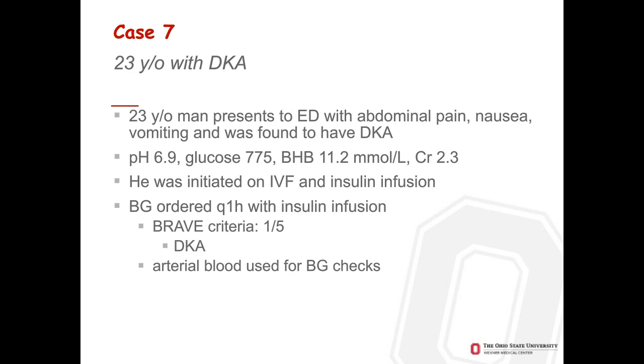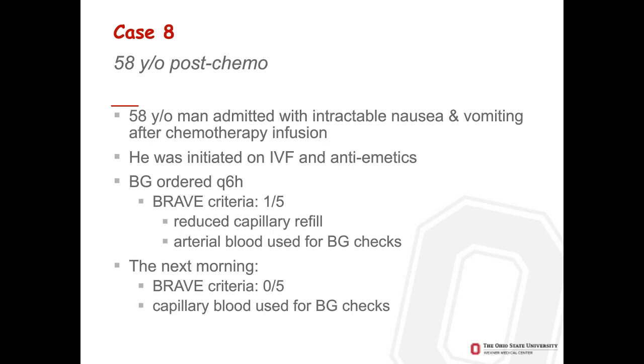Case 8 is a 58-year-old man who was admitted with intractable nausea and vomiting after chemotherapy infusion. He was initiated on IV fluids and antiemetics. Blood glucose checks were ordered for every 6 hours. BRAVE criteria showed that 1 of the 5 was present, which was reduced capillary refill.